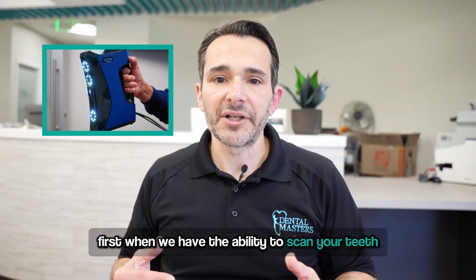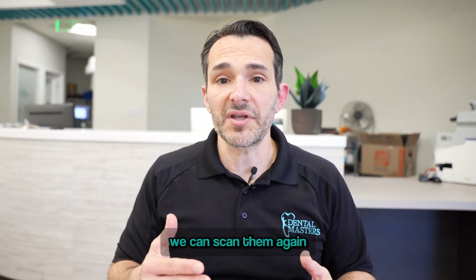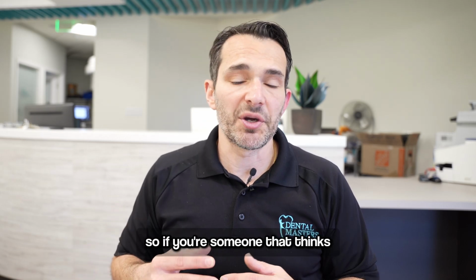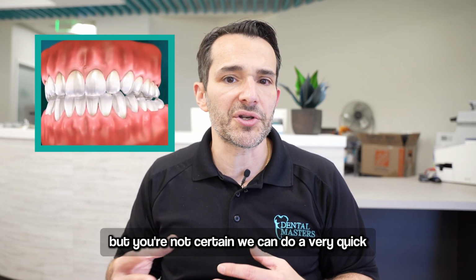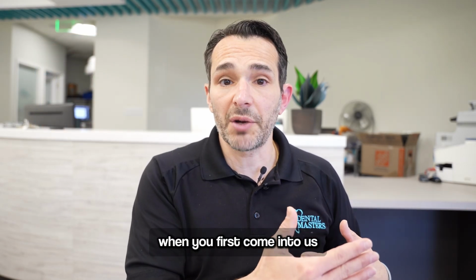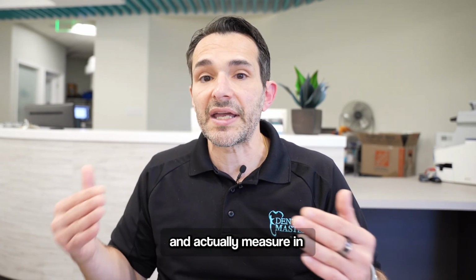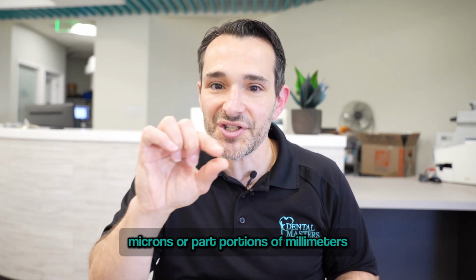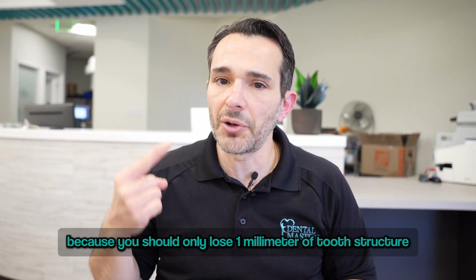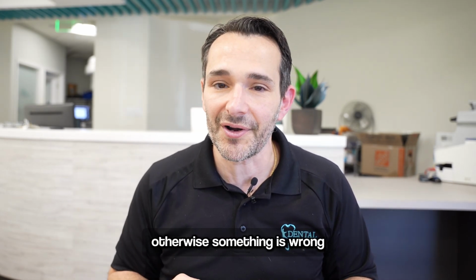First, when we have the ability to scan your teeth, when you come back in a year, by the way, we can scan them again and see, as like a wellness check, have your teeth changed. So if you're someone that thinks you're clenching or grinding but you're not certain, we can do a very quick three-dimensional scan of your teeth when you first come into us, and maybe a year later or 18 months later, and actually measure in microns or portions of millimeters how much tooth structure has been worn away. And that's important because you should only lose 1 millimeter of tooth structure in 100 years. Otherwise, something is wrong. But that's just one little way.